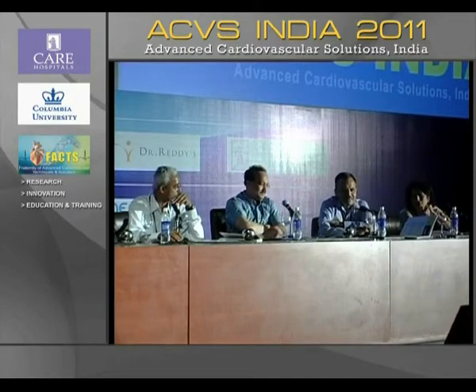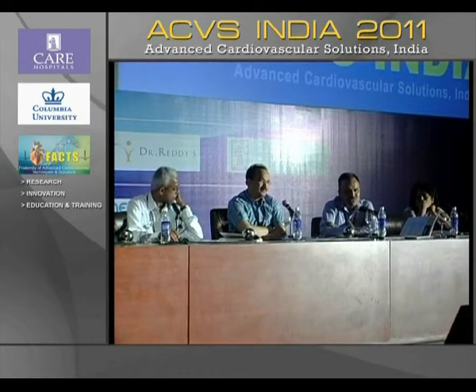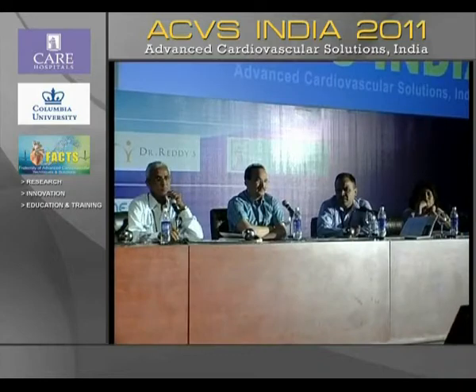Yeah, that absolutely illustrates that the commonest cause of perforation is the oversizing of the stent. And you have a point, Sushil? Yes.